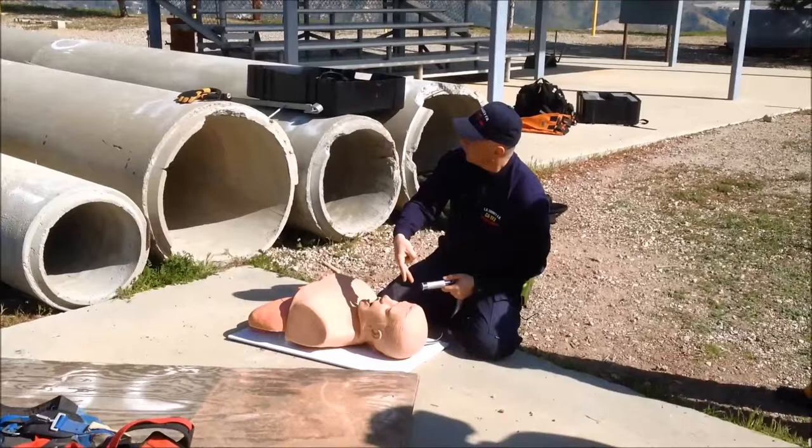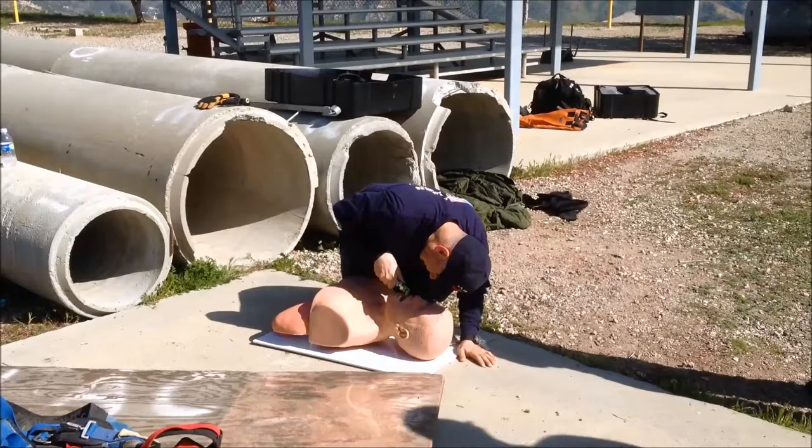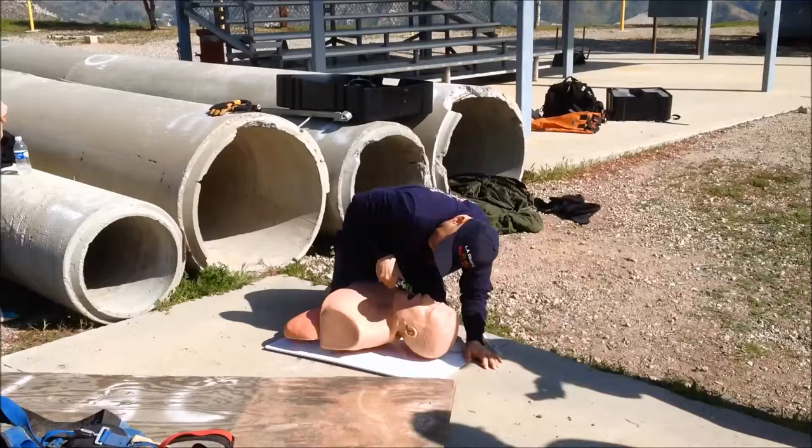When I intubate this patient normally from here, where are my eyeballs? They're right here. When you're coming from below, you've got to get your eyeballs in the same position. So you have to insert — put your head against his forehead and look down your blade. My handle, when I intubate, goes 45 degrees towards the sky. This handle has to go 45 degrees towards the sky.